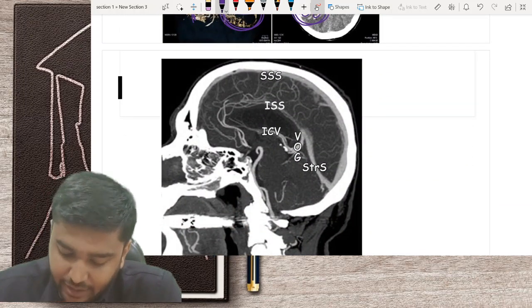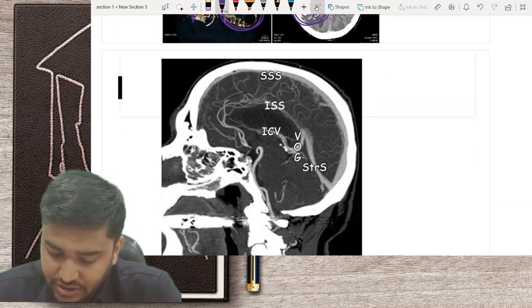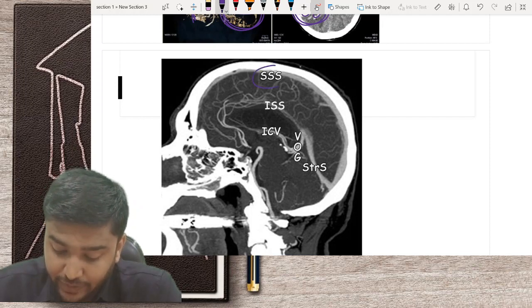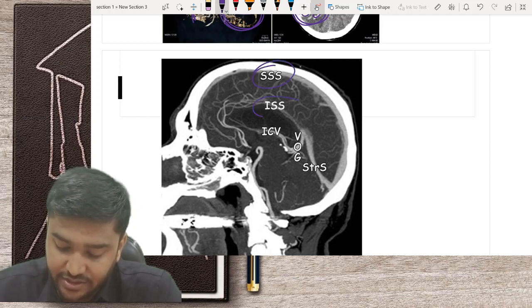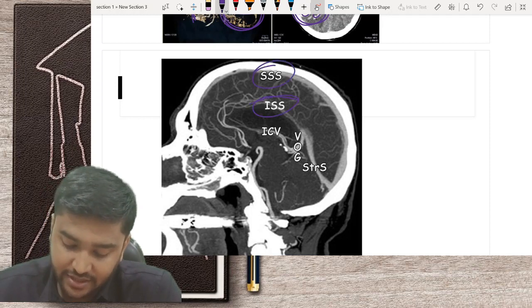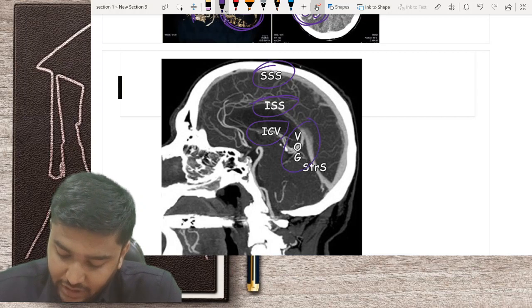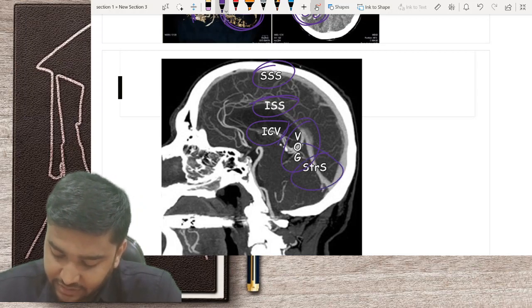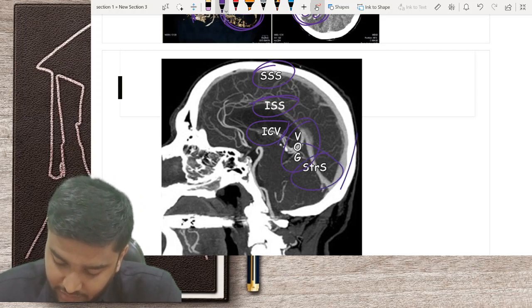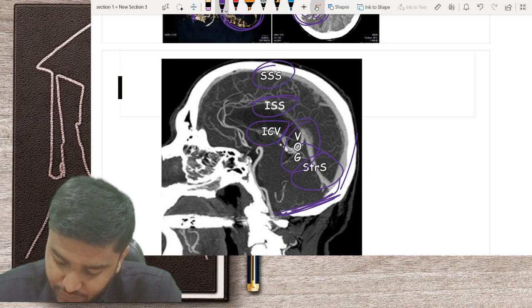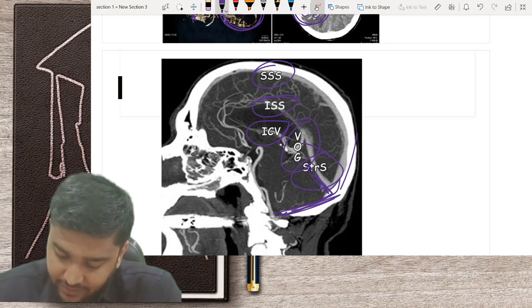This is a diagrammatic representation of how a CT venogram looks — you can see the superior sagittal sinus, inferior sagittal sinus, vein of Galen, straight sinus, sigmoid sinus, and transverse sinus.